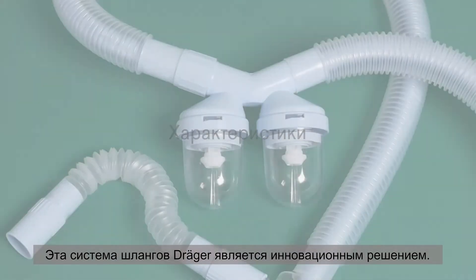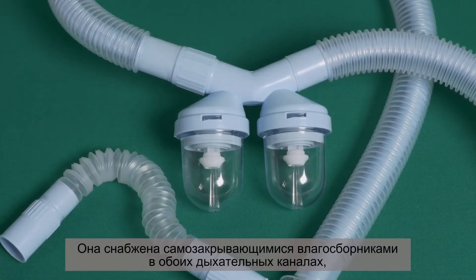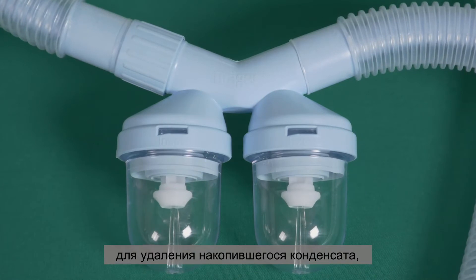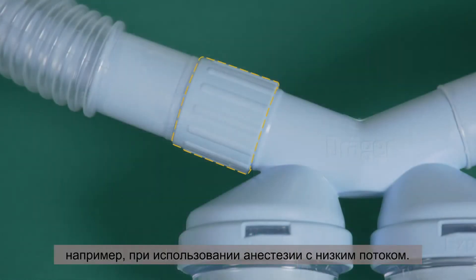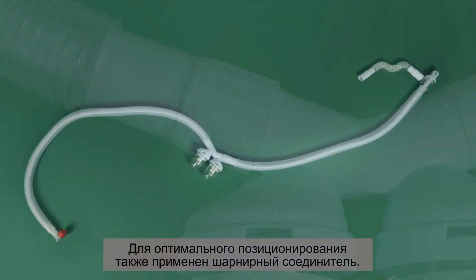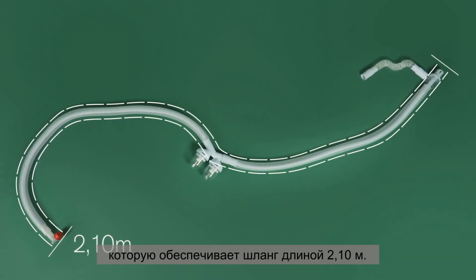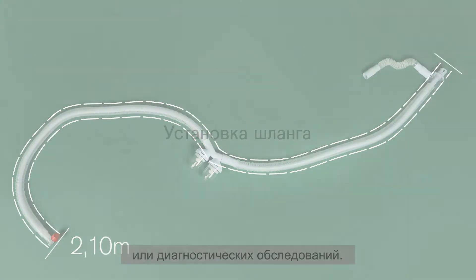With this hose system, Draeger is introducing an innovative solution. It has a self-closing water trap in both breathing branches — both inspiratory and expiratory — for removal of accumulated condensation, for example when using low-flow anesthesia. It also includes a rotatable connector for optimal positioning. Another property is its increased flexibility, due to the hose length of 2.10 meters, which is an advantage when positioning the patient during transport or diagnostic examinations.